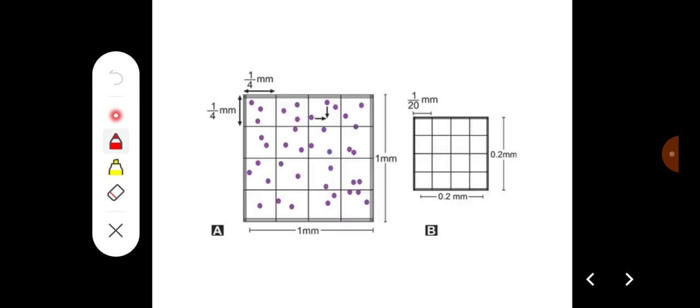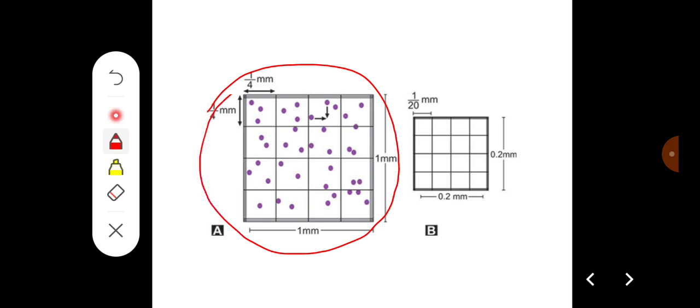And this is how the WBC counting chamber is going to be seen under low power. You'll be able to see all the 16 squares of each corner square, and you can easily count the WBCs in them. And this is how the RBCs are seen. So when you focus under high power, one of the intermediate squares is seen, which is surrounded by triple lines, and we have 16 small squares in them with RBCs.